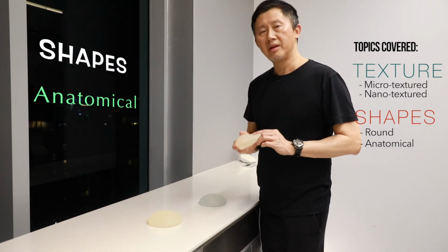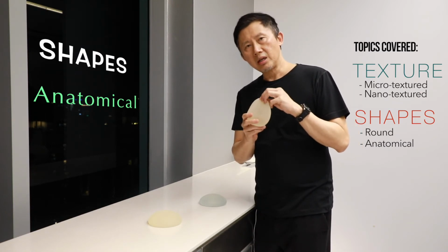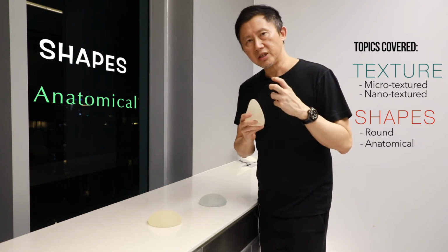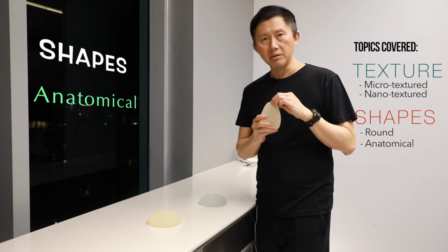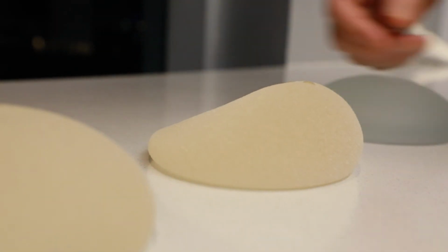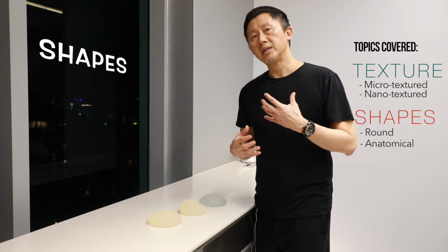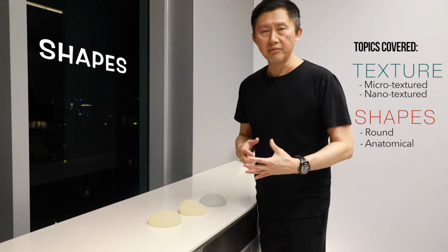But the problem with this implant is that in order to create and maintain this shape, the gel in the implant needs to be more firm, more stiff, so that it maintains its shape. So this means that the stiffer gel in this implant doesn't feel as soft as other types of silicone gels. Furthermore, because the implant is stiff, when you lie down, it still maintains the shape. It doesn't move with gravity. So it is somewhat stiff in terms of its movement, or shall we say lack of movement.